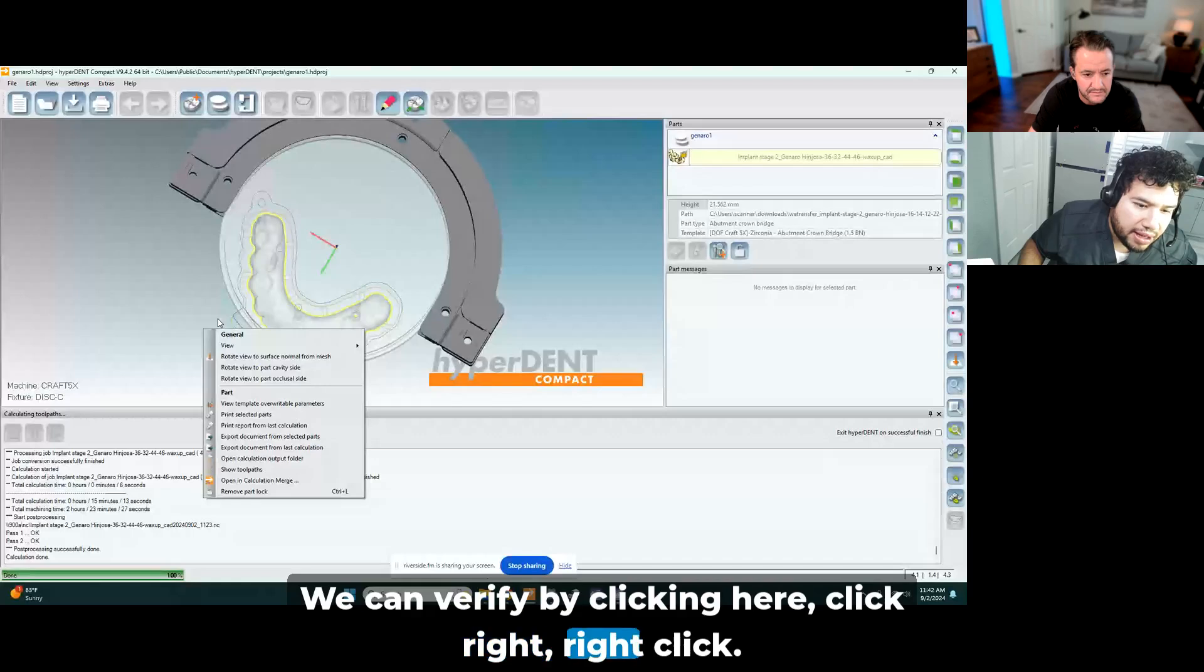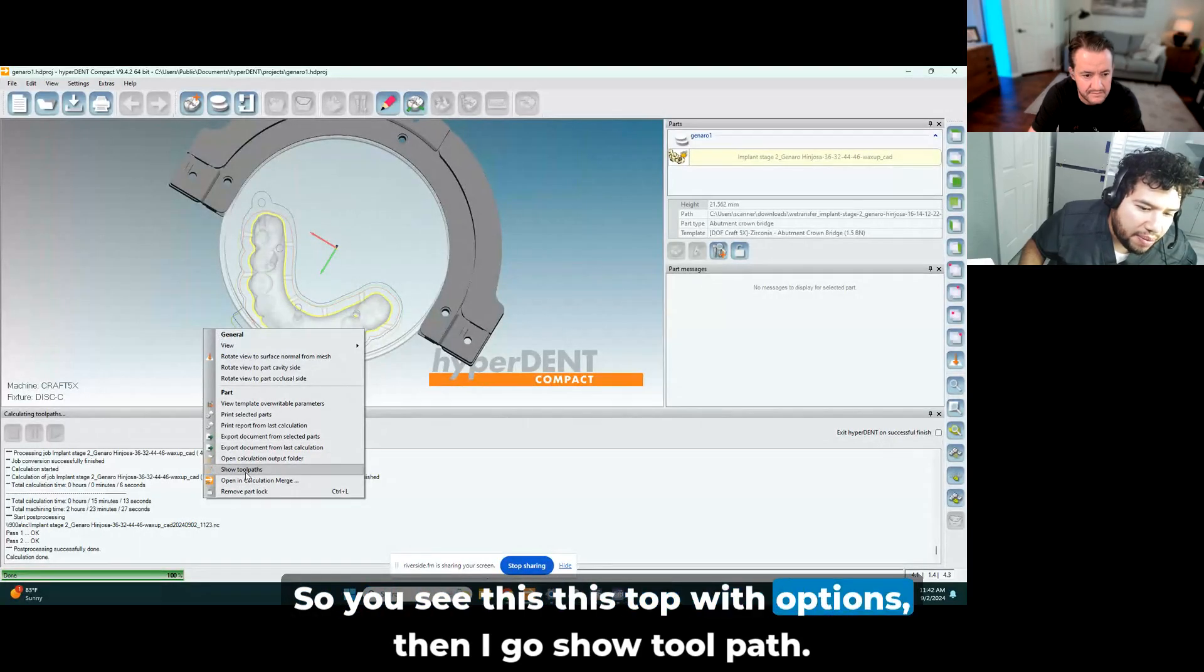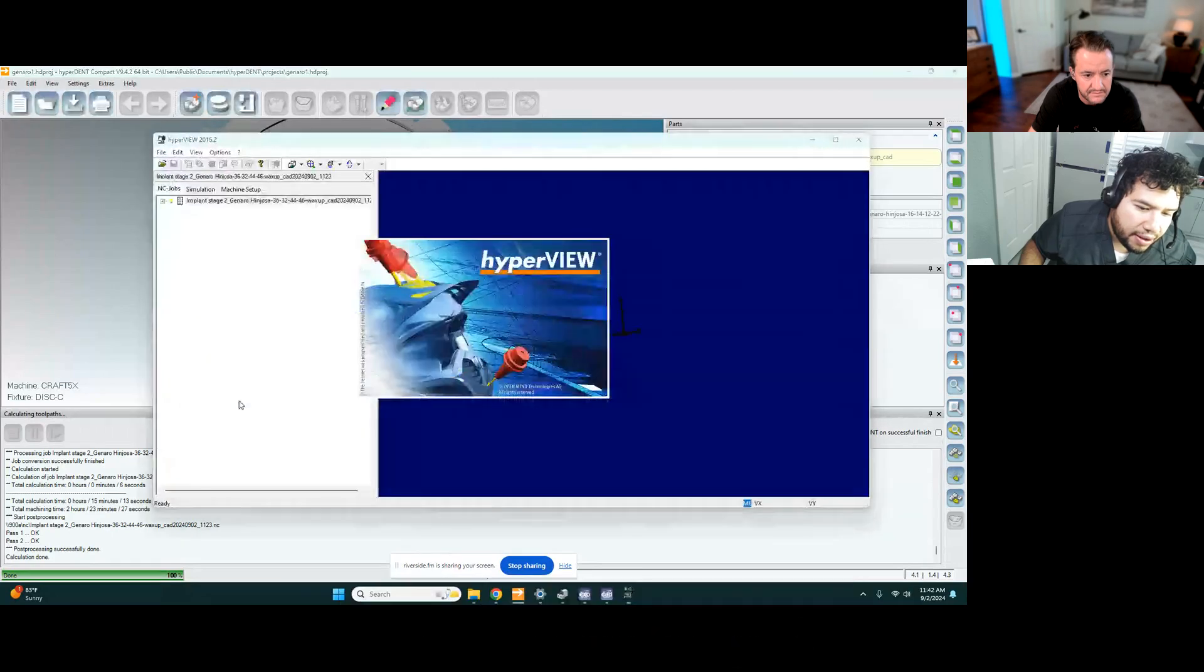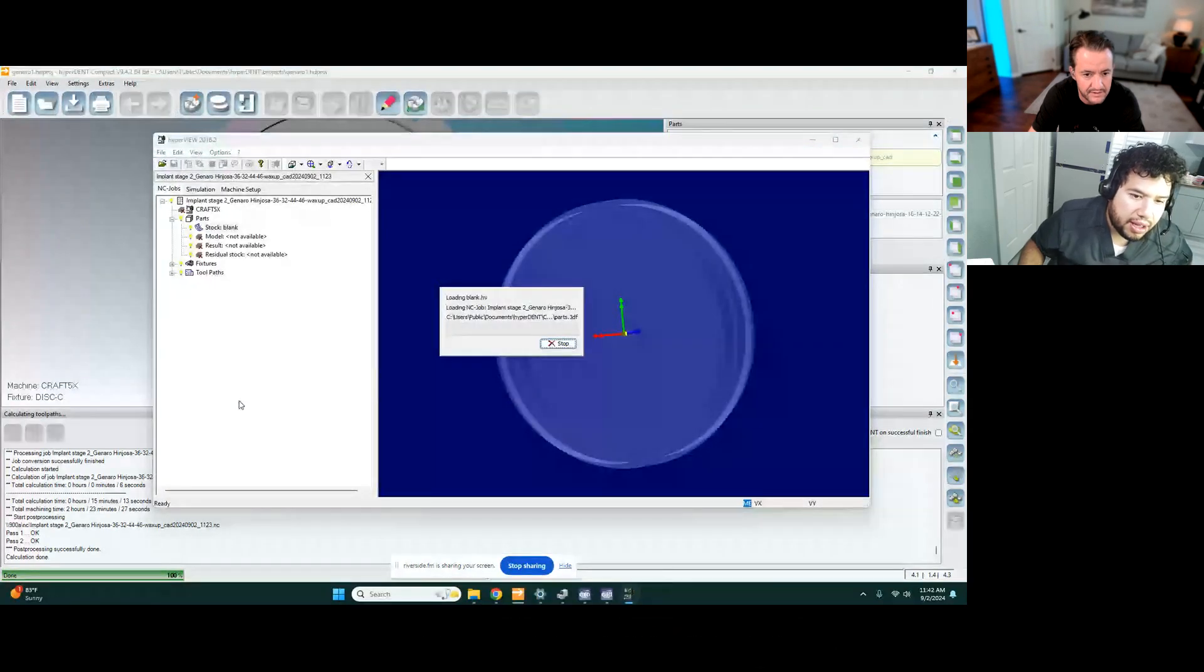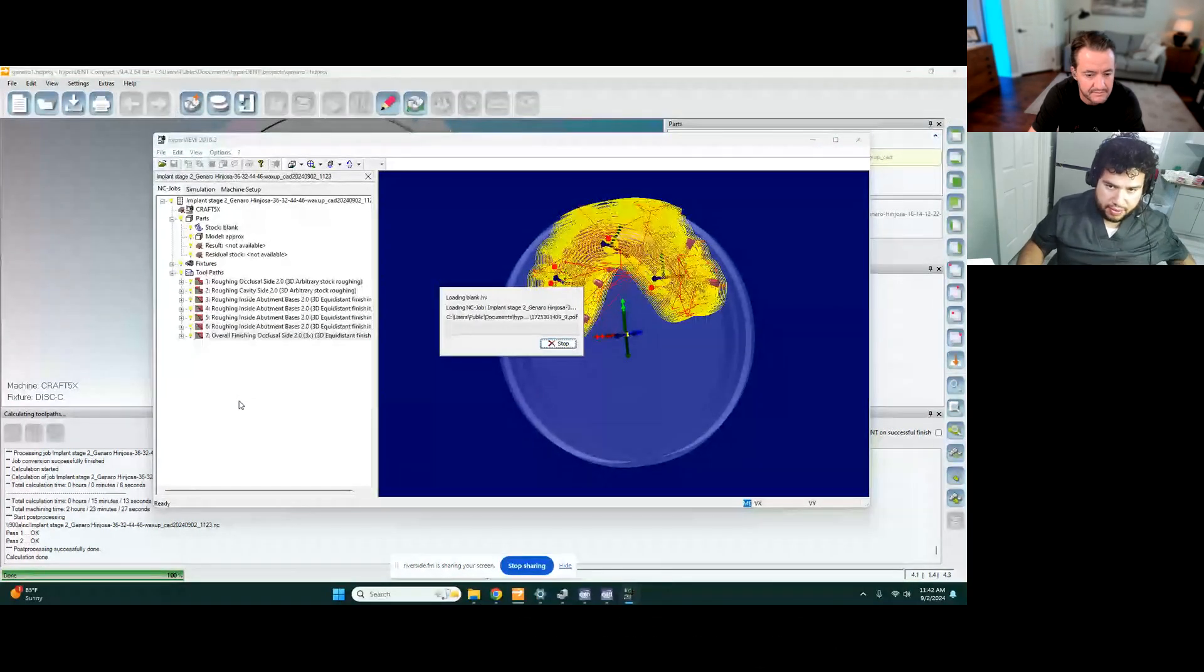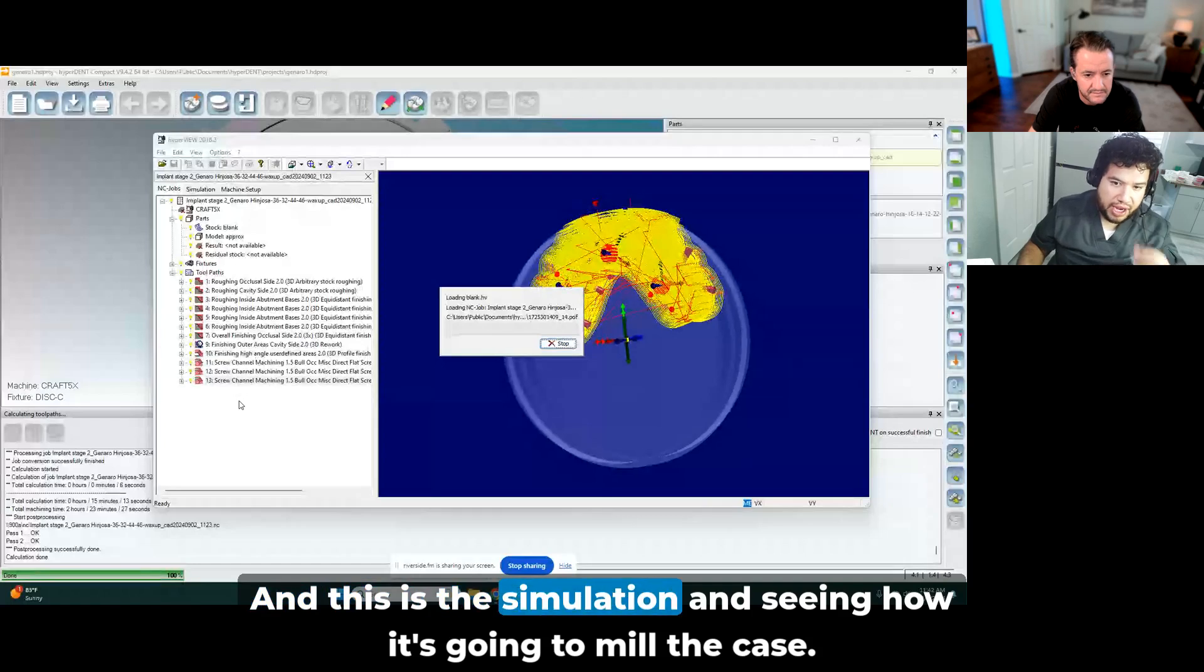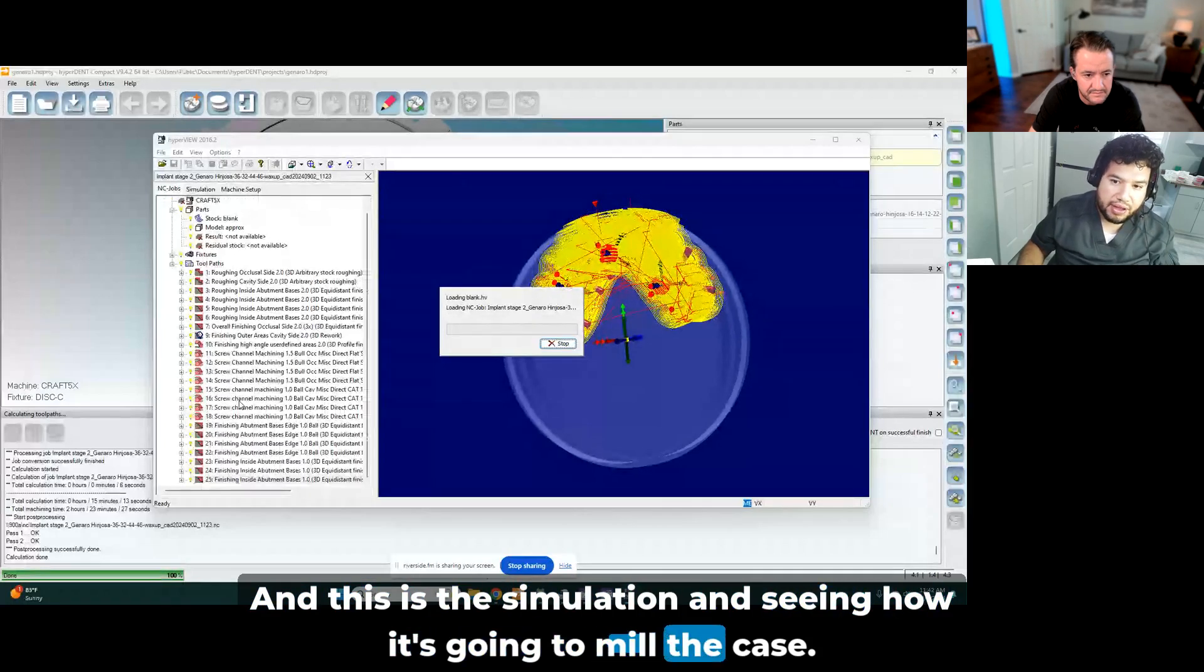So you see this tab with options. Then I go show toolpath. I click there. Okay. And this is the simulation seeing how it's gonna mill the case.